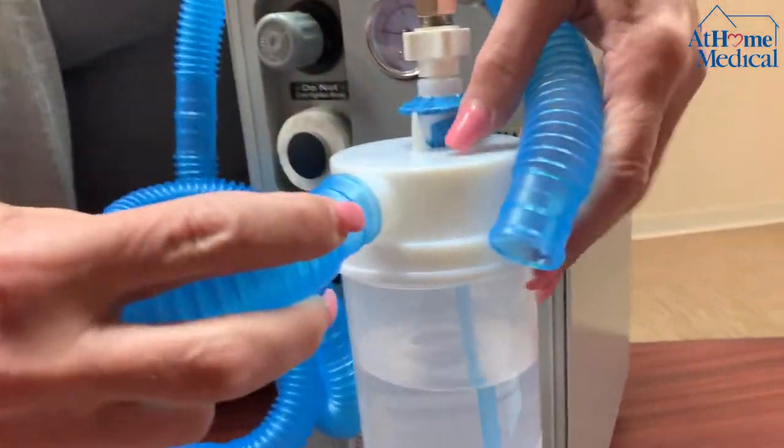Usually you make it about six feet. If somebody needs to move around in bed, or if they're using it just in bed or in a chair, you make it long enough for them to be able to move around. One end fits into the bottle.